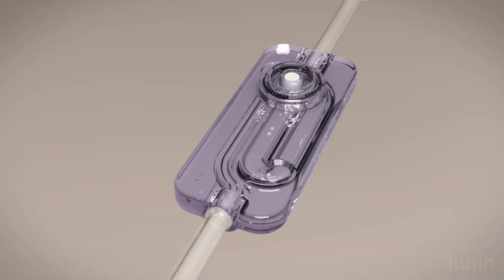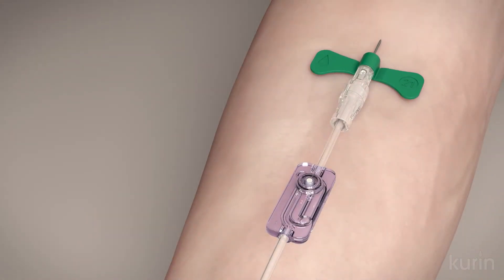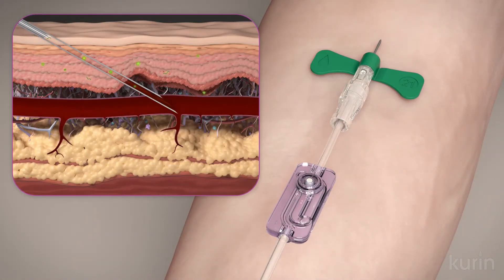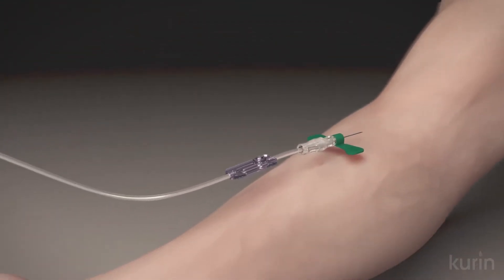The Kurin Lock with flash technology sidelines the initial flash of blood from an accessed vein to reduce skin contaminants that enter into the blood culture sample. Here is an inside look at the Kurin Lock in slow motion.